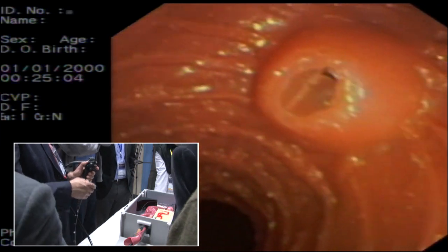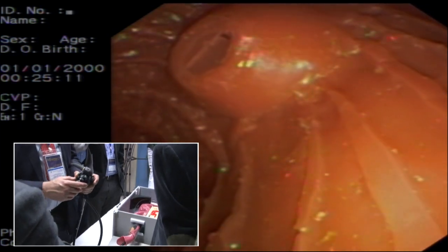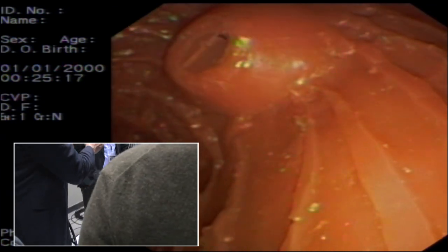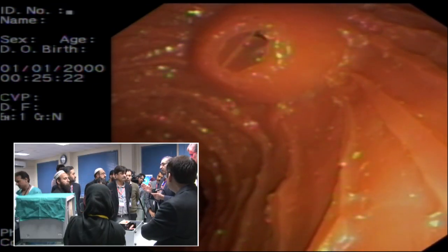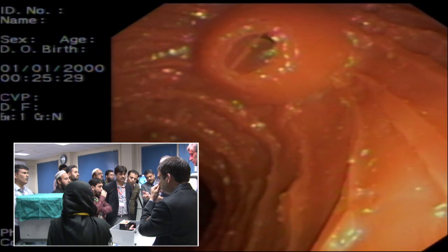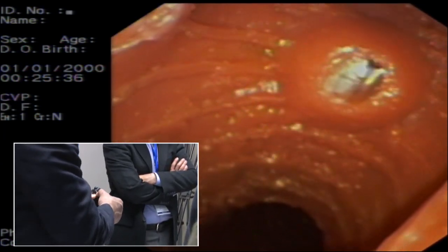So normally, to achieve this position, you put it in right lock, absolutely extreme right, and you move your body across it, because if it's in a short scope position, the scope tip will move with each movement you make. Even when you breathe, it will move, right? For the final go at it, you dial a little left. By normal extreme right, then you do a bit of left, and you can move your scope as well, which will reflect more, right?